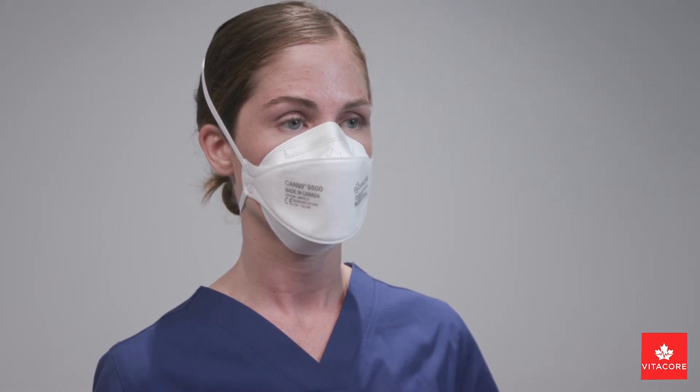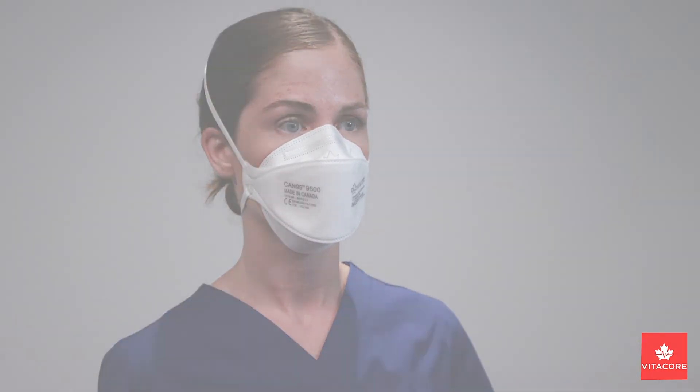If you cannot achieve a proper fit, please see your infection control or employee health and safety department for direction. Do not enter an infectious or hazardous area.